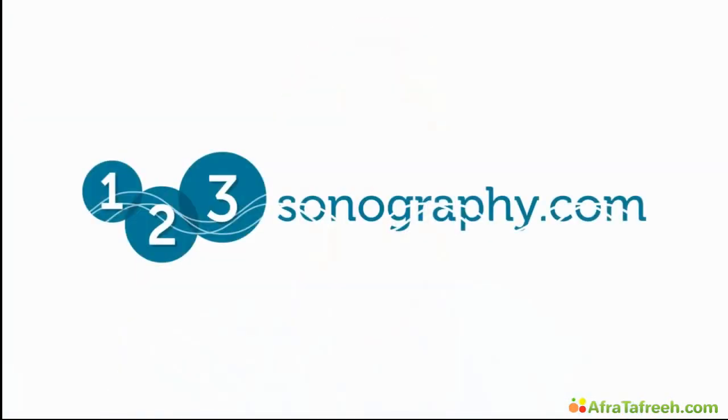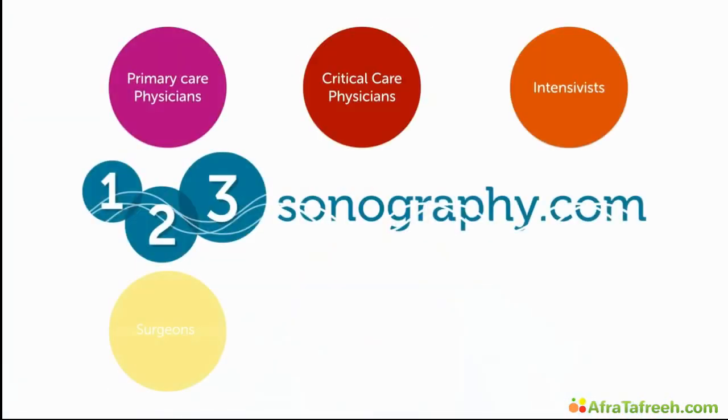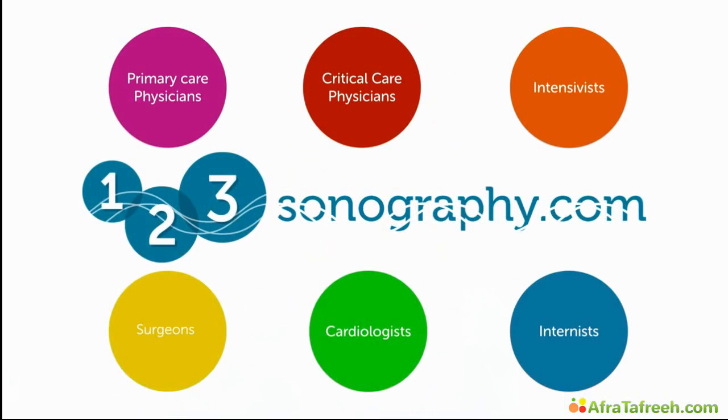We have been in the same situation, but we discovered a fascinating tool we want to share with you: sonography. Being able to perform abdominal sonography will make all the difference. Join us on 123 Sonography. We are going to teach you everything you have to know to become an expert in abdominal ultrasound. Follow us now on a fascinating journey into the world of abdominal ultrasound.